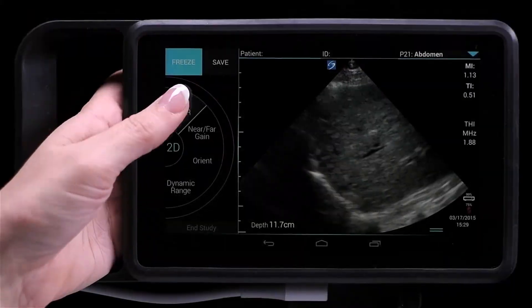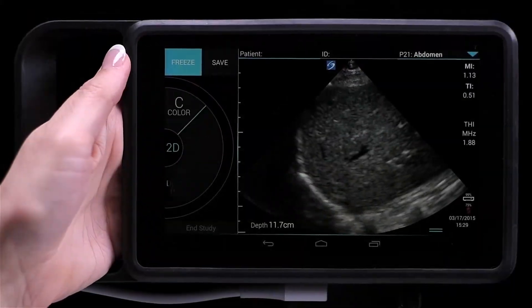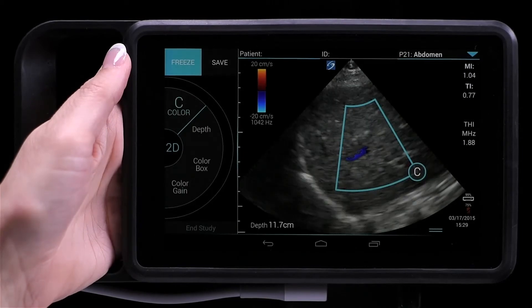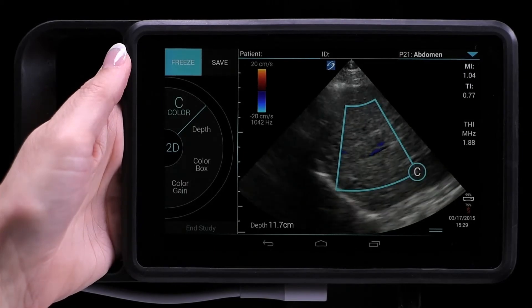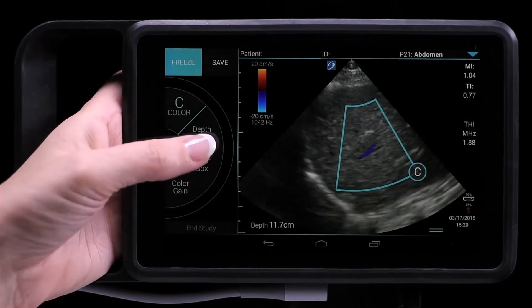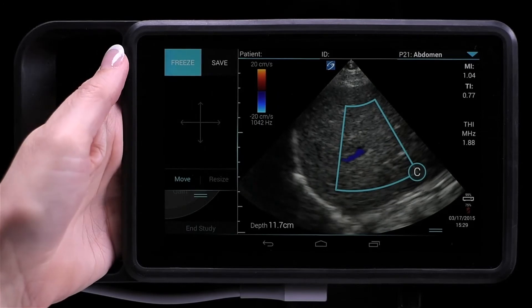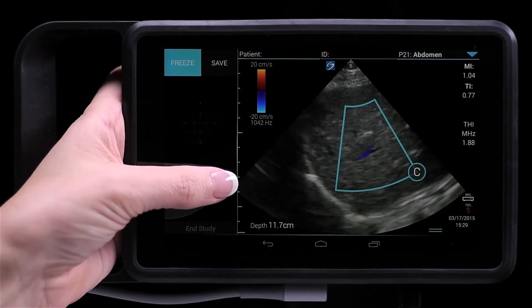Tap Color on the control wheel while in 2D. From here, you can adjust other color parameters, such as box size.